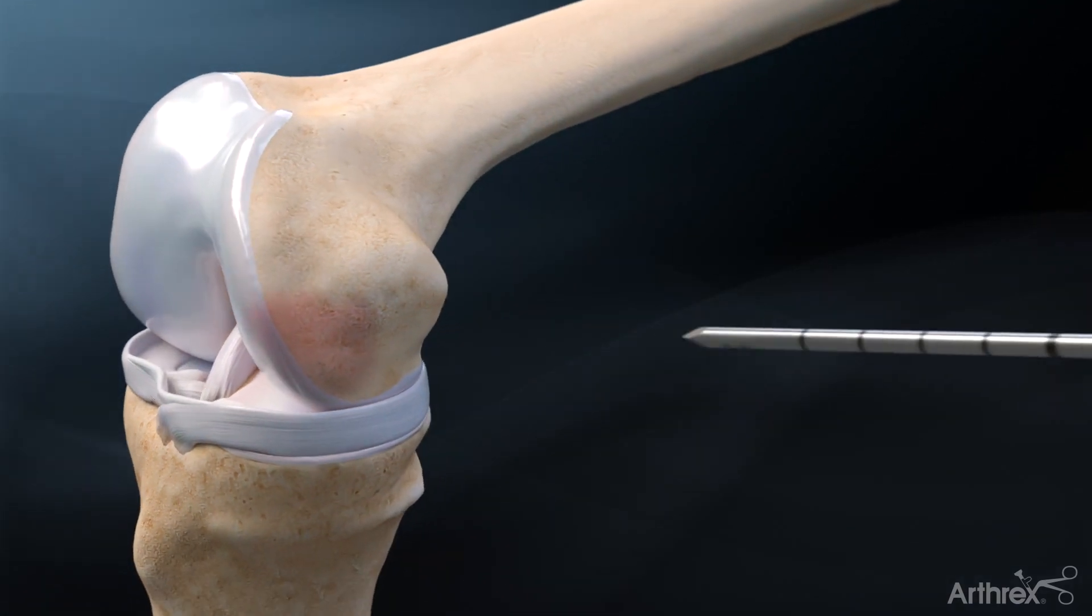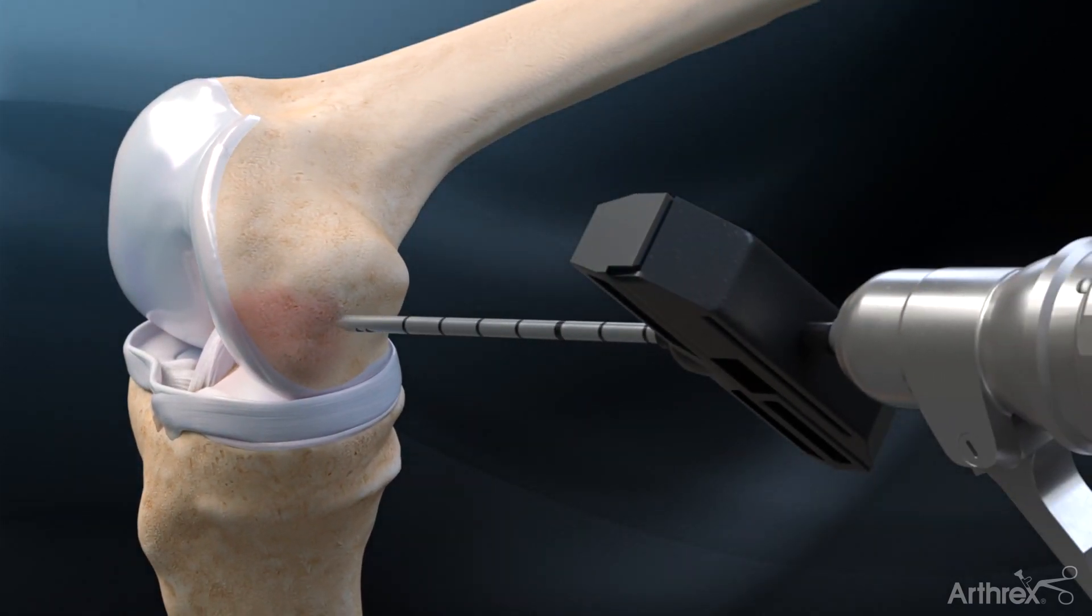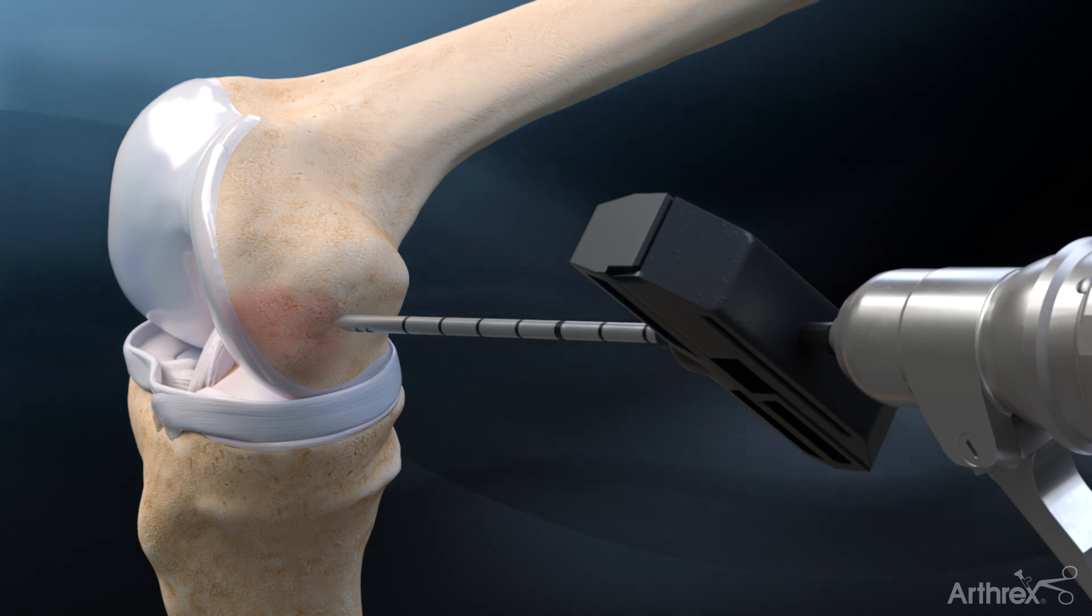First, position either the open tip or closed tip delivery cannula adjacent to the bone marrow lesion according to the MRI.